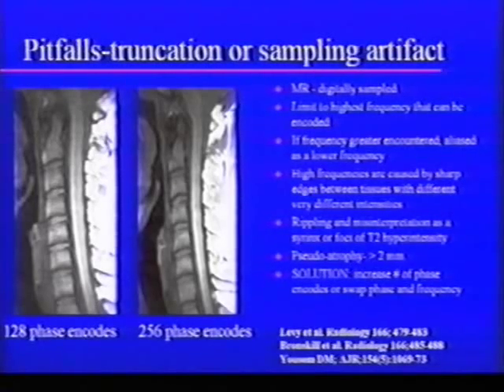You want to put together a picture by lots of curvy waves. And the more sharp the transition, the more curvy waves you need, okay? We call it phase encoding. If you don't do enough phase encoding steps, what happens when you get to an interface that's dark signal and then bright is you get this reverberation, okay?